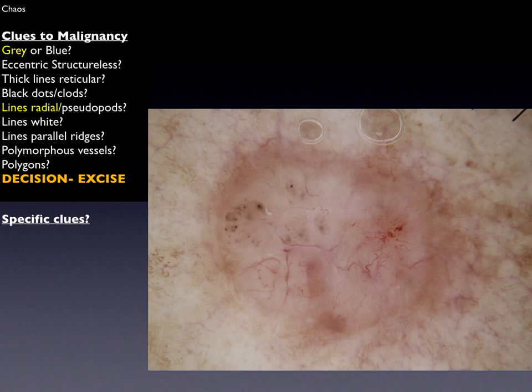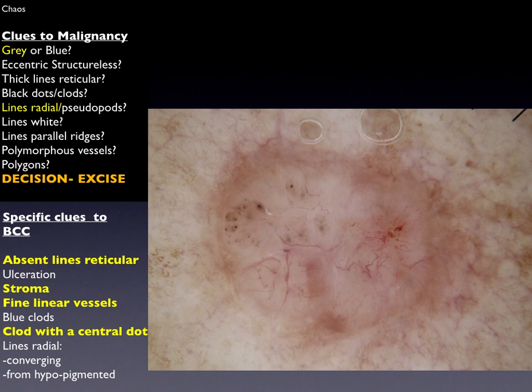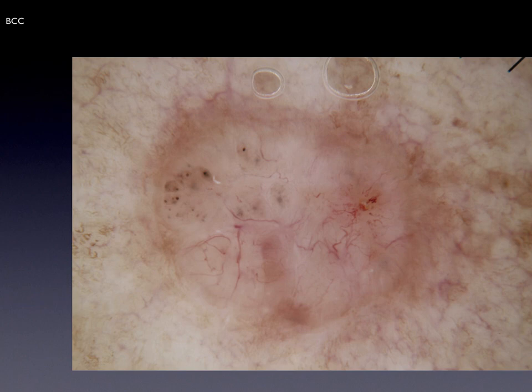The lines radial segmental are extending from the pigmented structures in the top left of the lesion. Looking for specific clues to the diagnosis, we find absent lines reticular, BCC type stroma, clearly different from the surrounding skin, fine linear vessels, and clods with a central dot. These clues are specific to BCC, as well as lines radial converging extending from the clods on the right-hand side of the upper part of the lesion — again pointing specifically to basal cell carcinoma.